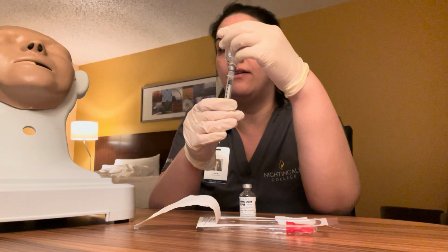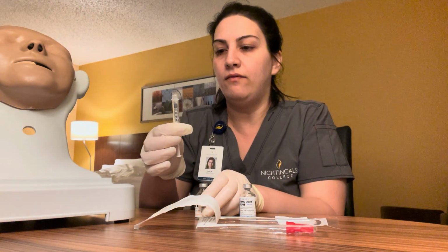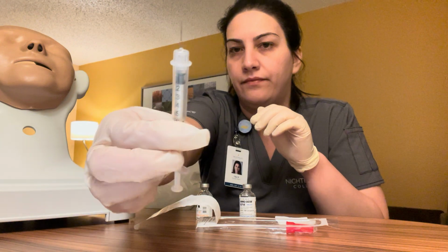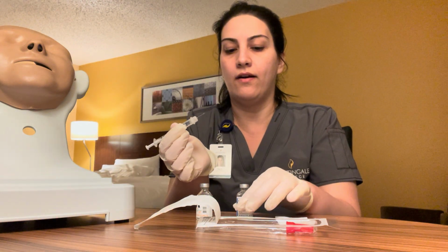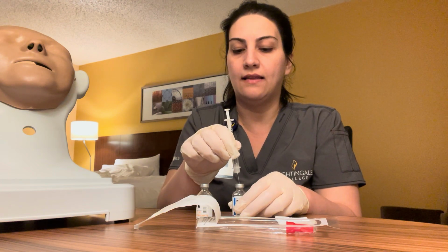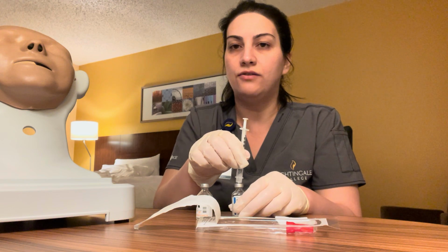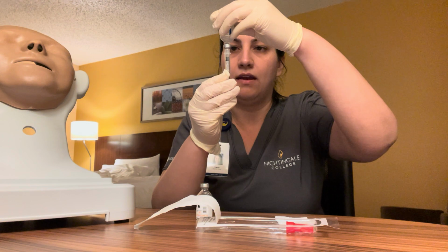I'm going to tap if there's any bubbles. There's no bubbles. 4 units of insulin. Nurse and I verify against the MAR, 4 units of regular insulin. Next, I'm going to tip it over. I'm going to make sure that I get the NPH of 8 units, totaling to 12. I want to make sure that I don't inject any of the regular solution. I'm going to tip it over, use it like a pencil. 8 units.